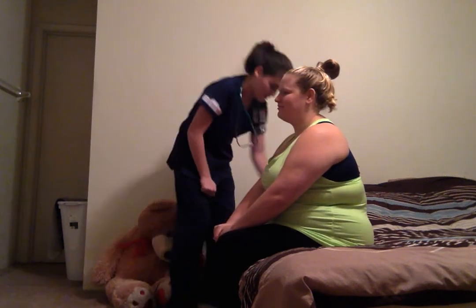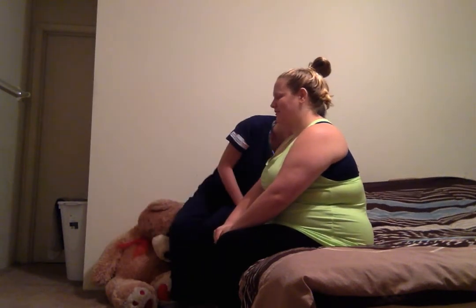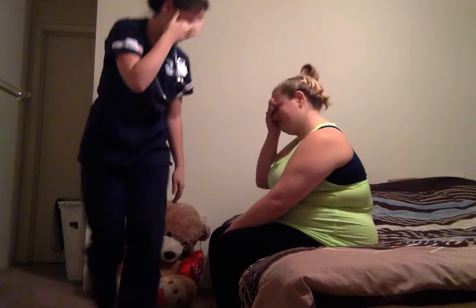And now I'm going to look inside her ear with my pretend little thing. And I see that her tympanic membrane is intact and goes to the center, and that it's pearly gray, and there's a cone of light reflex. And it's at 7 on this side, and I'm going to go to the other side. And I see the same thing with cone of light reflex at 5.